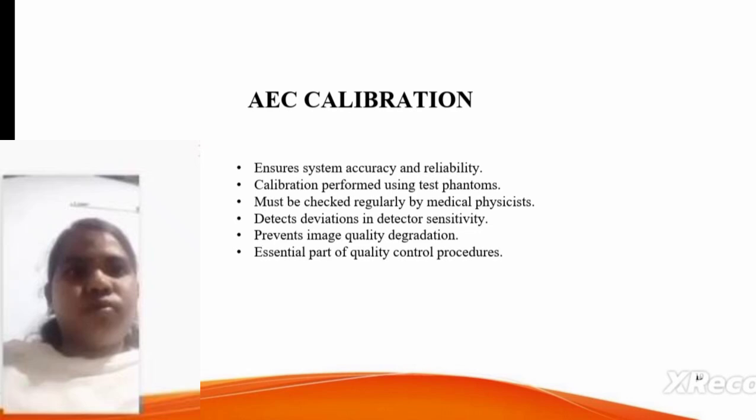Automatic exposure control calibration ensures system accuracy and reliability. Calibration is performed using test phantoms and must be checked regularly by medical physicists. Detecting deficiencies in detector sensitivity prevents image quality deterioration.